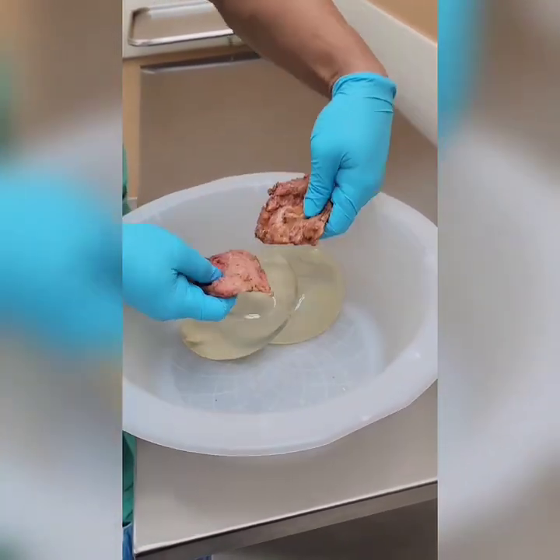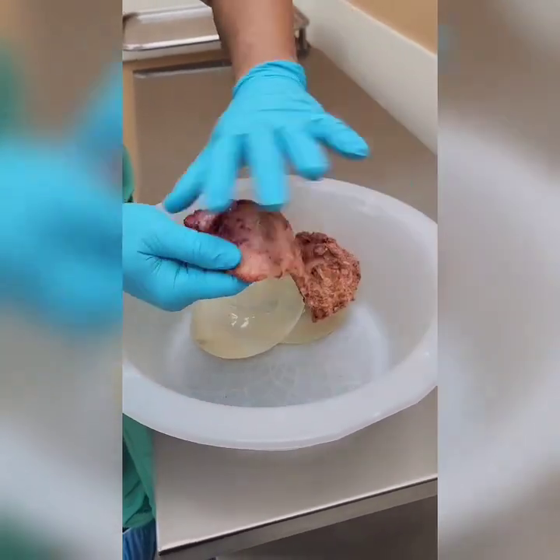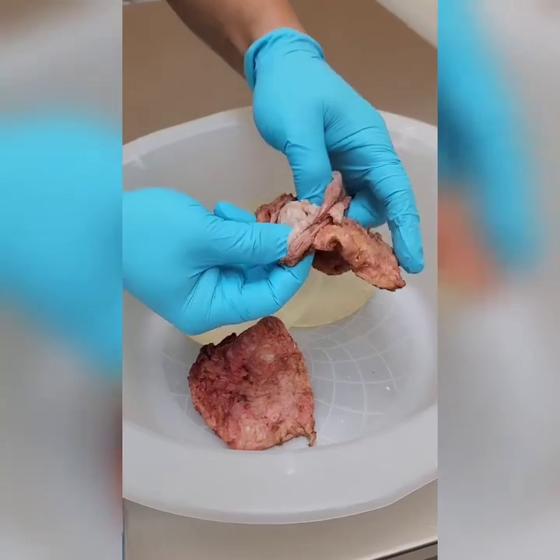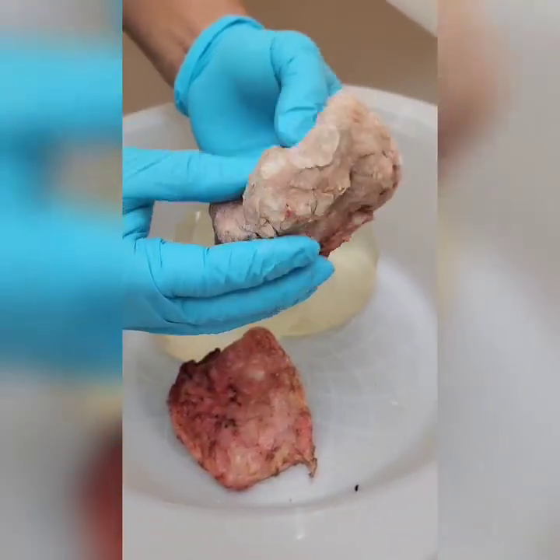So these are the capsules I removed from around the implants. Okay, this surrounds the implant. Now here's the issue. Let's turn it inside out so we can see. You can hear the crunchiness and look at all this calcium, okay?